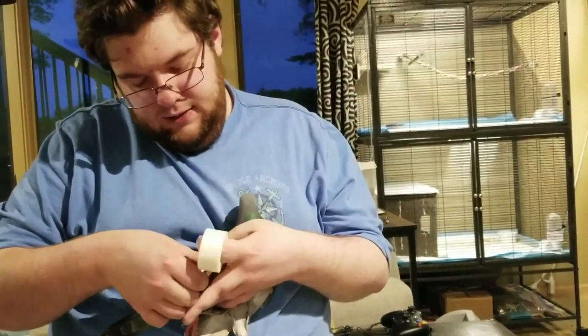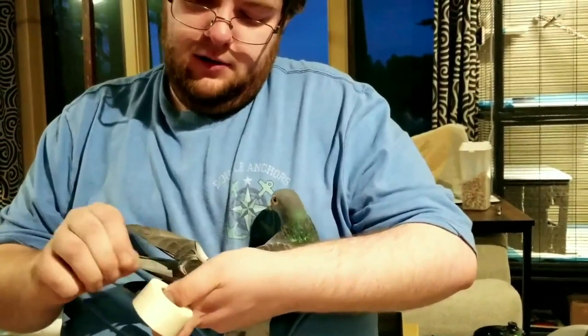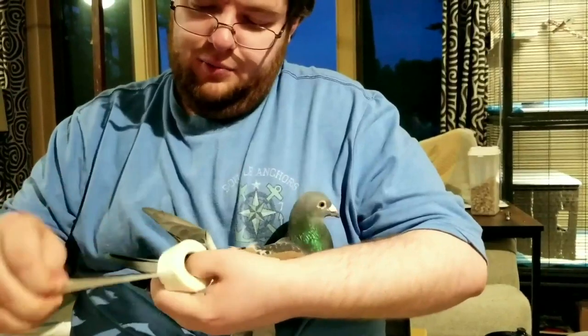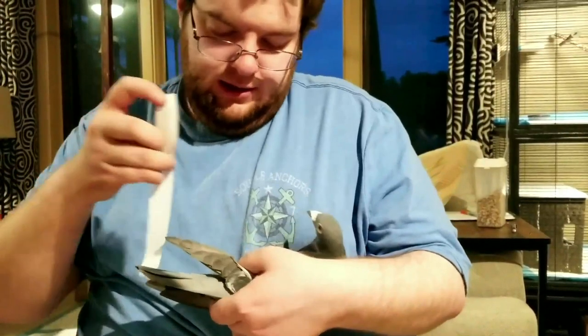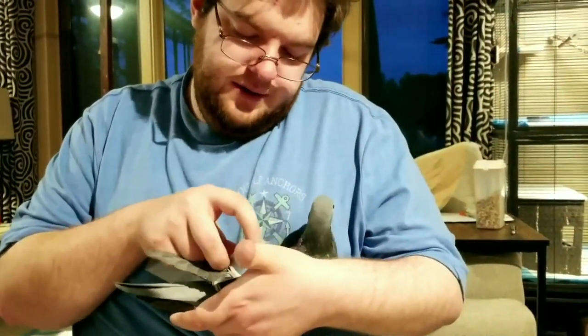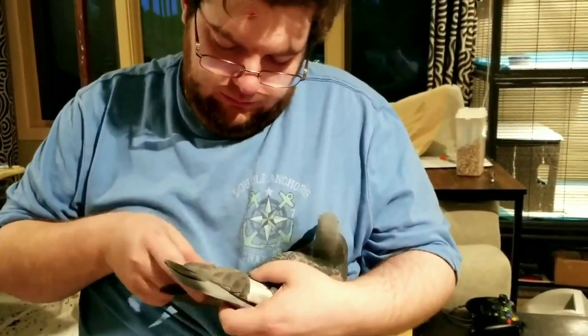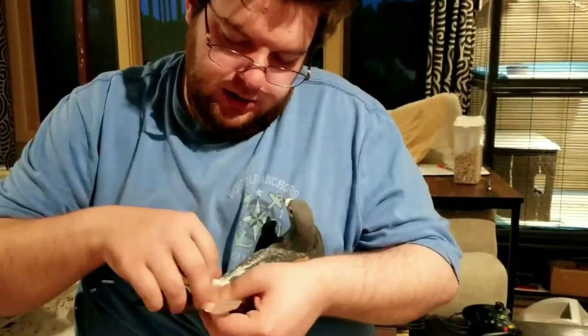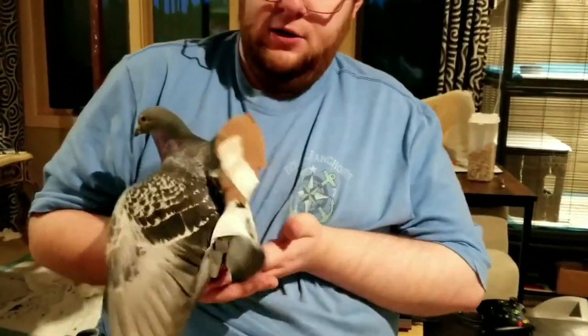So that is how you wrap the wing. I'm going to use the DuraPore as well here — you can use the MicroPore, but this to me is a little more durable and stable. So I take this. You're probably going to lose a couple feathers; don't be too worried about that. They've probably got a broken or injured wing and aren't going to be needing them too badly anyway. But that is how you kind of sling it so it doesn't droop.